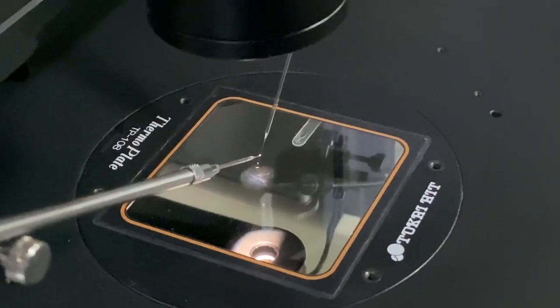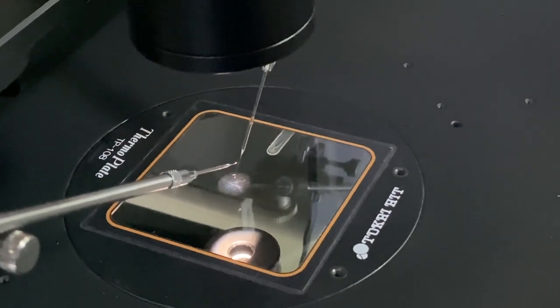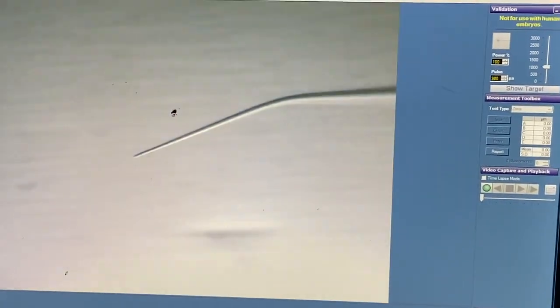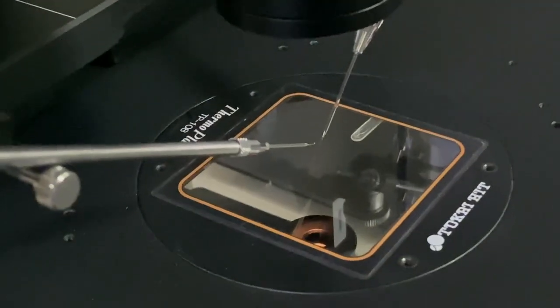Now in this machine I can see it properly, but I think I can show it more towards here. You can see the needle. I will just straighten it up a little bit. Once it is visible, that means it's focused. You can see the needle clearly there. Similarly, I will bring this holding needle. I will drop it a little down because it is still very high.